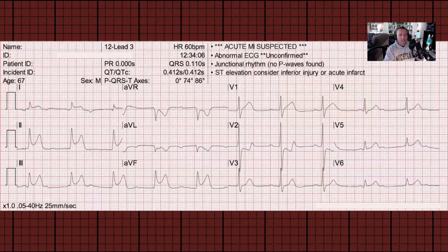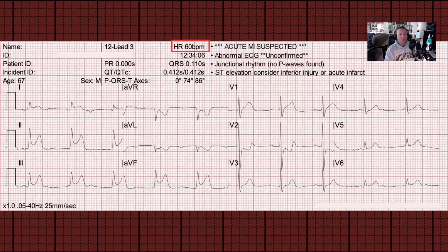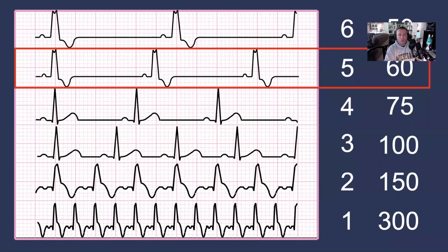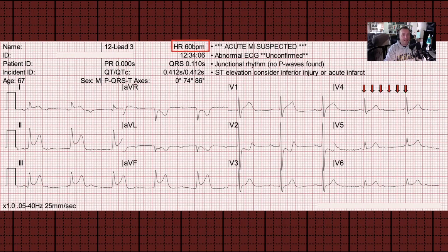Let's try 60 beats a minute. There are 60 seconds in a minute, and five large blocks on ECG paper make up one second. So there should be five large blocks in between R waves. Finding an R wave that lines up with a large block — let's use this one in lead V4 — and counting: one, two, three, four, five. Proving that this heart rate is 60.